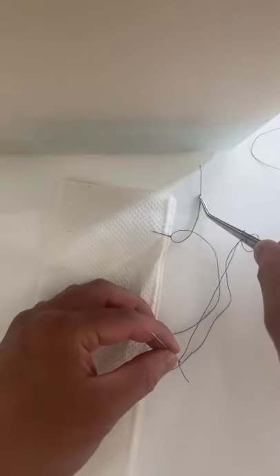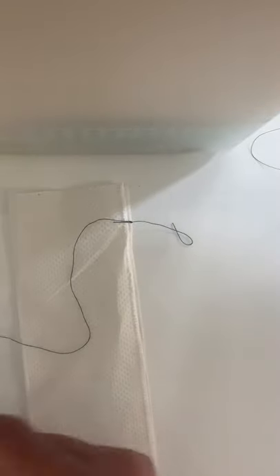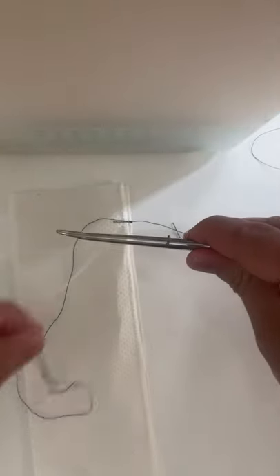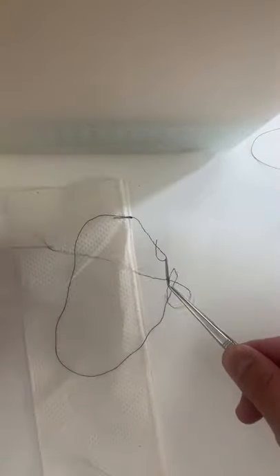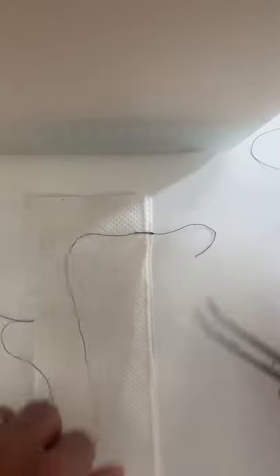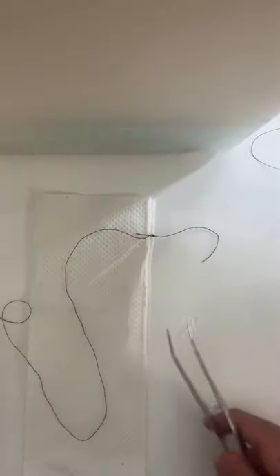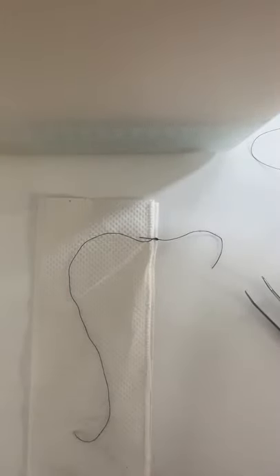We're going to grab the back end here and pull through, and then lastly we're going to go once in the reverse direction. I'm going to hold my cotton pliers so you can see the point of reference. Instead of going forward, I'm going to go reverse once, then grab the back end here and pull through to secure my knot. If this were an interrupted suture we would cut these two pieces, but now we're going to do a running stitch or a continuous suture.